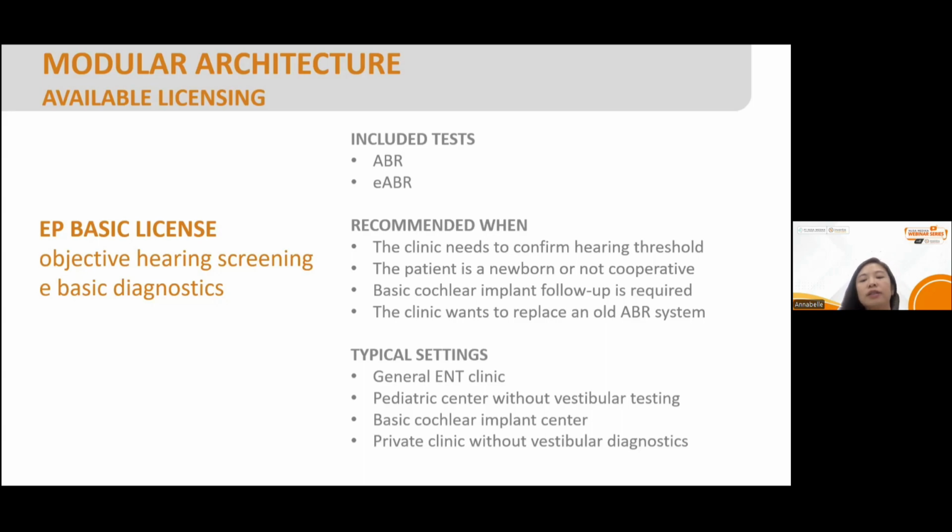And if you have a center, you want to open a new clinic just for audiology and not vestibular testing, then I think the EP basic is good enough.